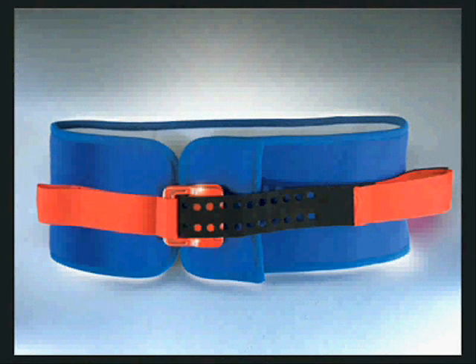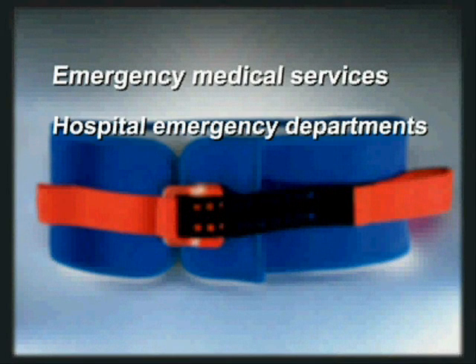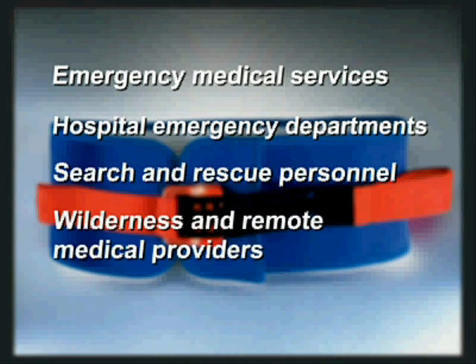The SAM Sling. The intended users of the SAM Sling include emergency medical services, hospital emergency departments, search and rescue personnel, wilderness and remote medical providers, and military.